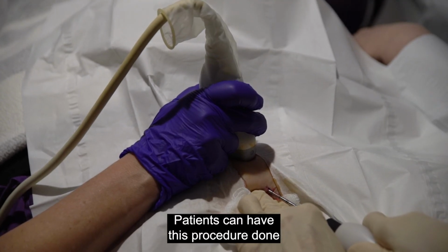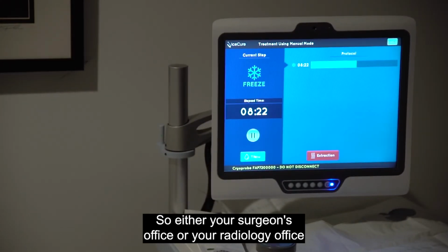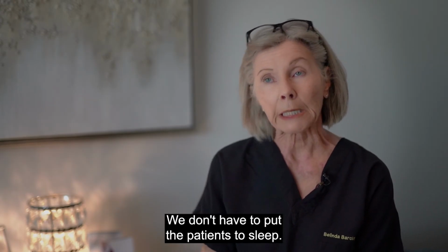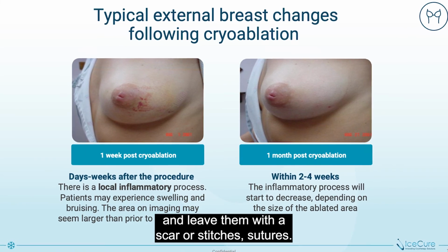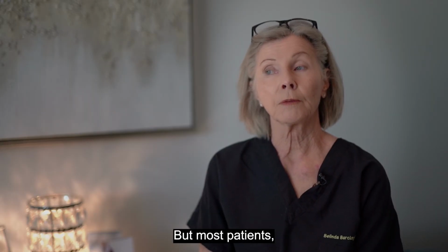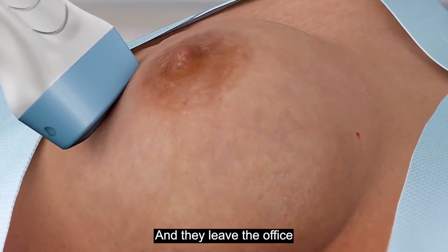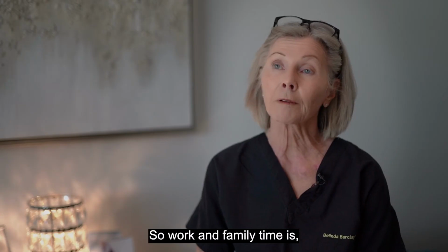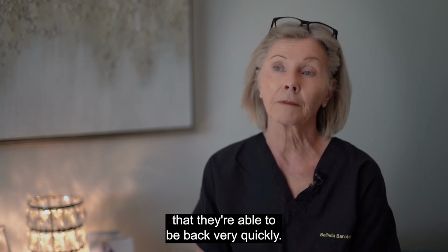Patients can have this procedure done in an outpatient setting, so either your surgeon's office or your radiology office, but not in a surgical suite, which is fantastic. We don't have to put the patients to sleep. We don't have to cut the skin and leave them with a scar or stitches. It's a very quick procedure, depending on the size of the tumor, but for most patients the procedure doesn't take longer than half an hour. And they leave the office with a steri-strip on the skin and they can go back to work. So work and family time, they're able to be back very quickly.